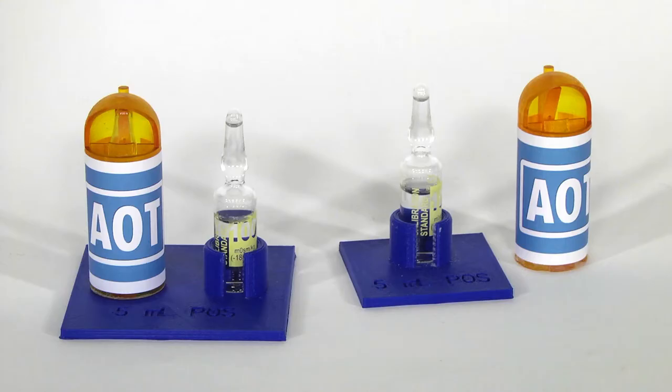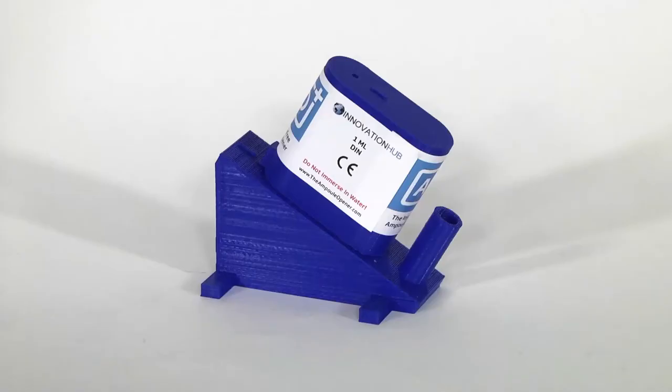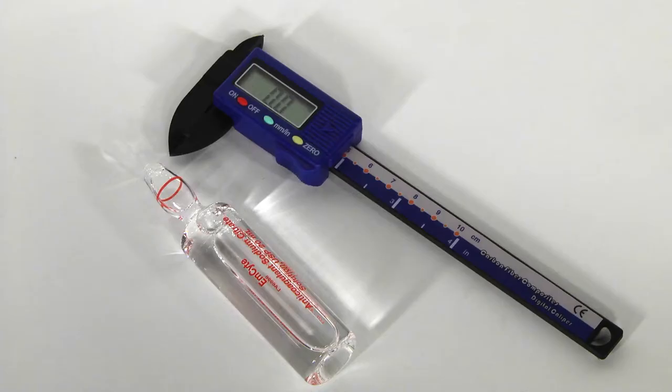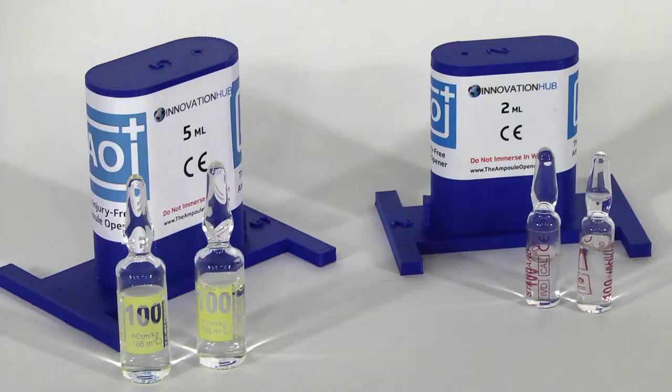AOT can be made with its own safety base or without, just like AO. We can make AO Plus and AOT to suit any size and design of glass ampule made in the world today and in the future. All we need to achieve this is samples of the ampules, or the manufacturer's specifications, or accurate measurements of the ampule you are opening.